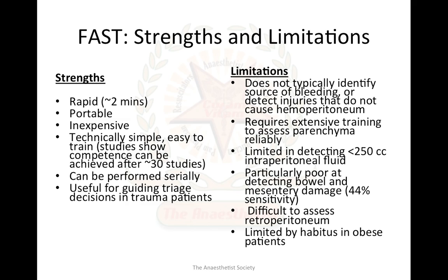As such, I have learned FAST from this forum from Dr. Piyush Malik, and then I attended a 2 day workshop at Ahmedabad. It can be performed serially, and we are doing it regularly in the operation theater, and we have detected many positive FAST in the operation theater when patients are sent to the OT with some other injuries from emergency without scanning the abdomen. It is useful for guiding triage decisions in trauma patients, but there are certain limitations also.